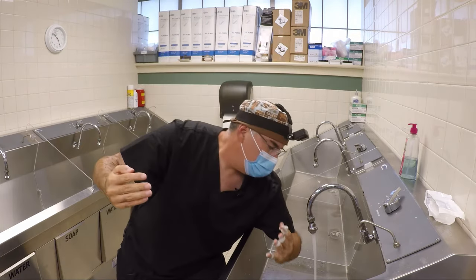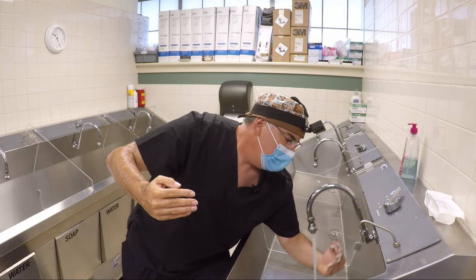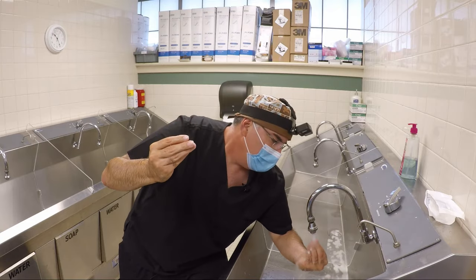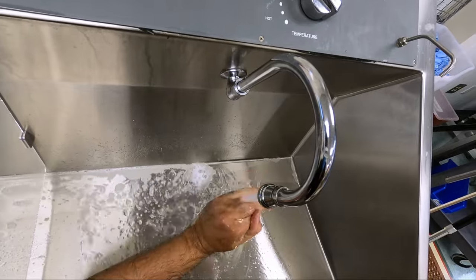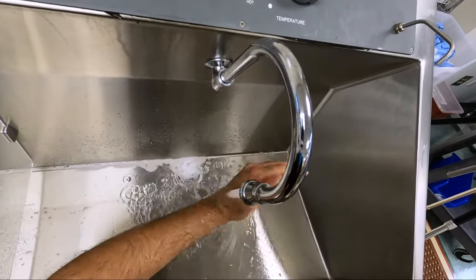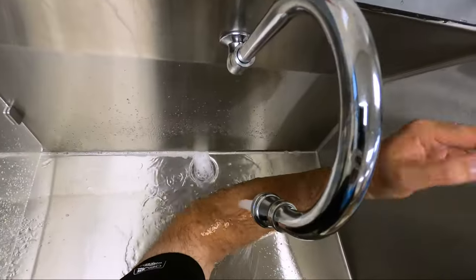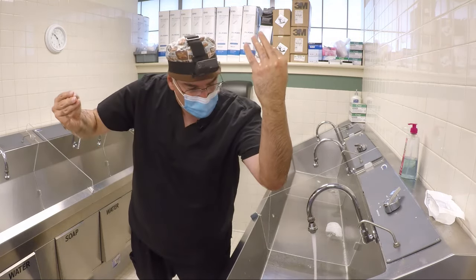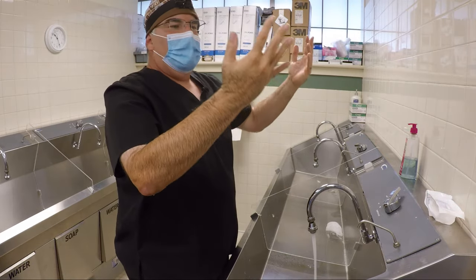Elbow down. You can come in this way. Some people come in from the back and put your hand in here. Keeping these fingers up over here, watching what you're doing. Rinse this hand first. Make sure you get all that soap off of there. Spend some time. That's okay. Now, once you've got your hand cleaned, back and forth, back and forth, back and forth. Fingers are still pointing up, all the way up to that elbow and around. And look at that water dripping off of there. Perfect. Good job. All right, so now my hands are clean.